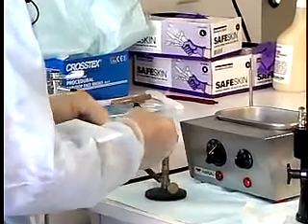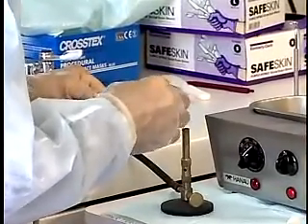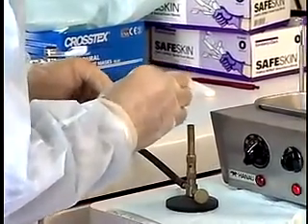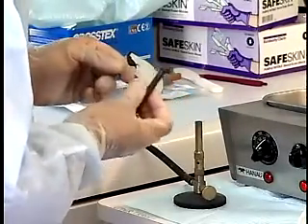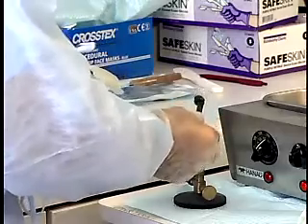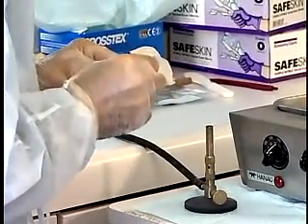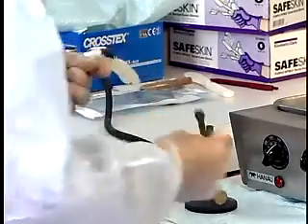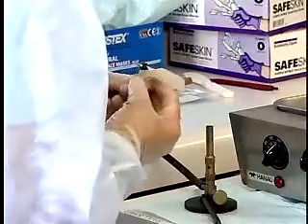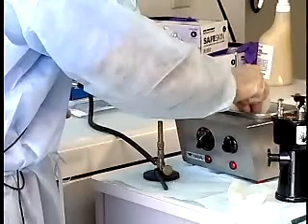Soften one end of the green stick compound slowly over an alcohol torch. Place the compound along the anterior border of the dry tray from the buccal frenum area of one side to the buccal frenum area of the opposite side. Flame the compound with a Hanau torch. Temper the compound by placing it briefly in a 140° Fahrenheit water bath.